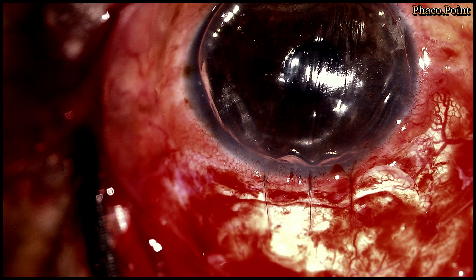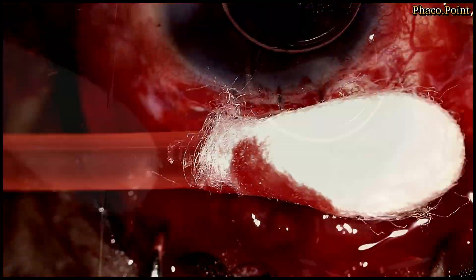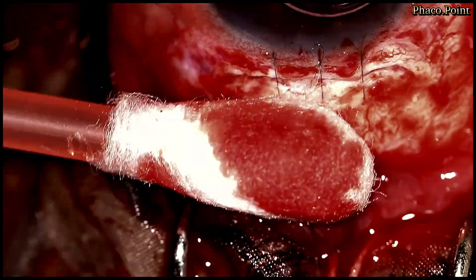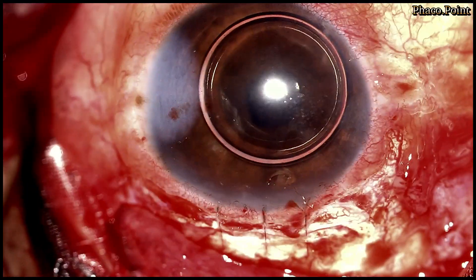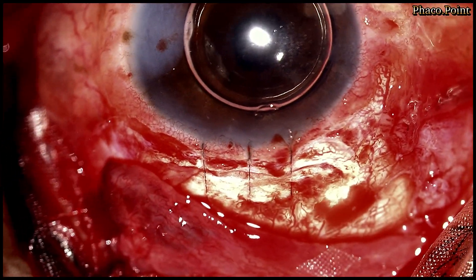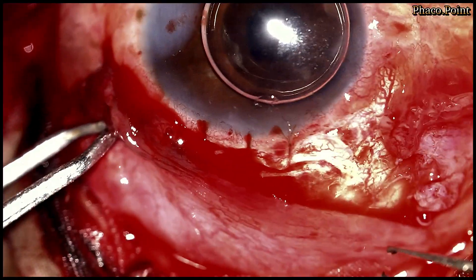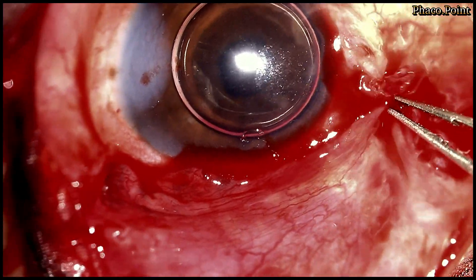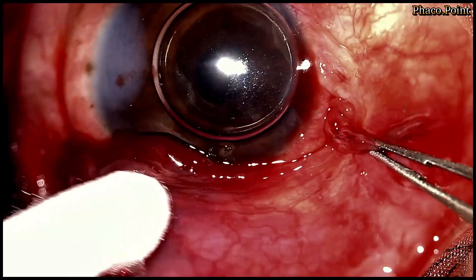This is followed by the hydration of the paracentesis incision. The retracted conjunctiva is then drawn up towards the limbus and either end of it cauterized.